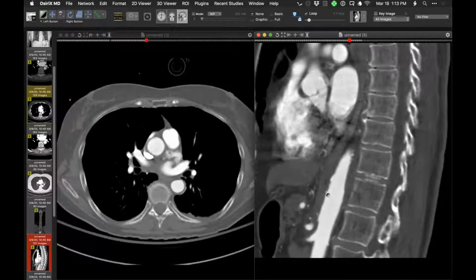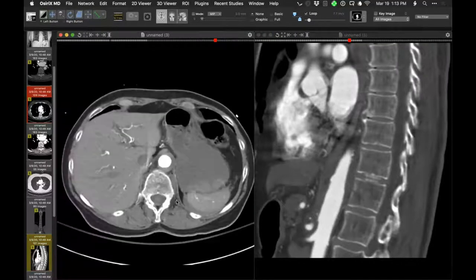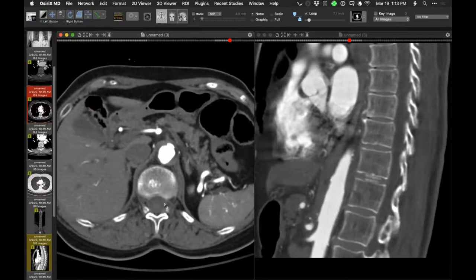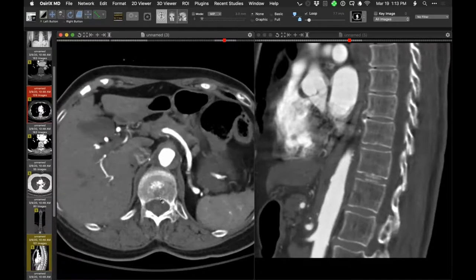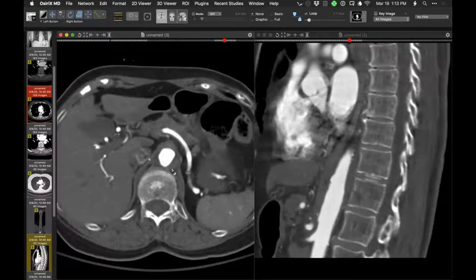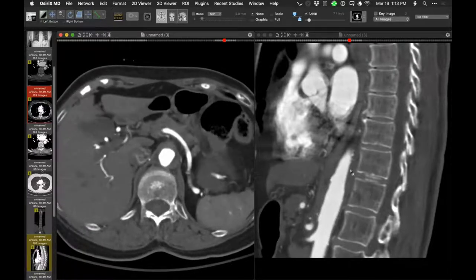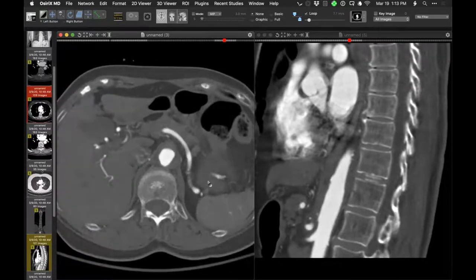And perhaps here. Let me get to the corresponding location on the axial projection and magnify it a little bit. So the fracture is there. But in an older person, it might be hard to separate out the calcified lumen from intraluminal thrombus. But I think these findings here, circumferentially around here, are very suggestive of maybe an intramural hematoma in the wall of the aorta in very close proximity to the vertebral fracture. And that's certainly how we read it out.